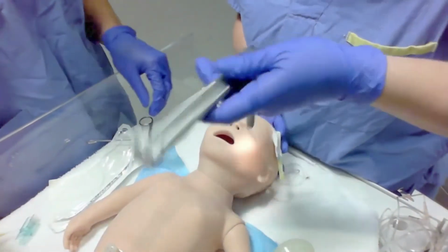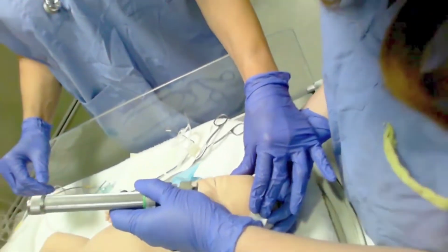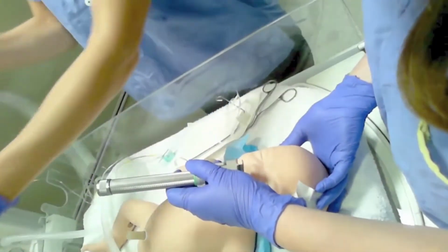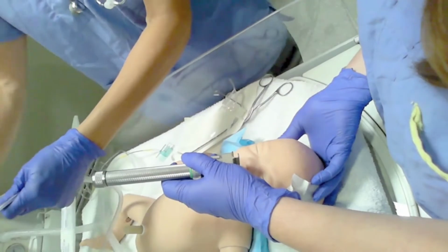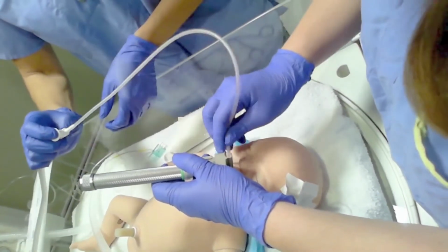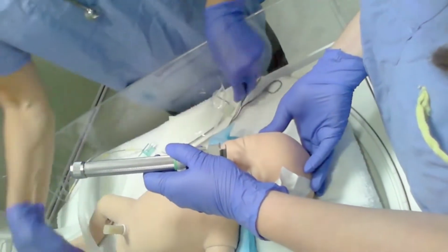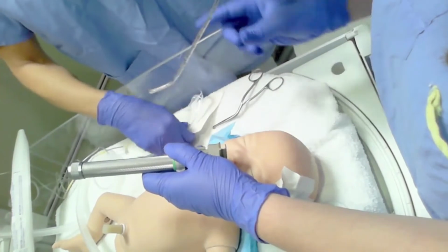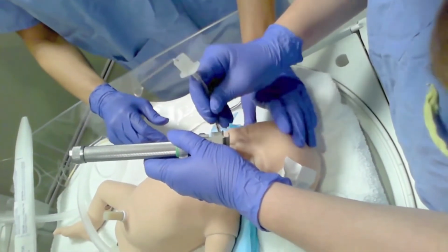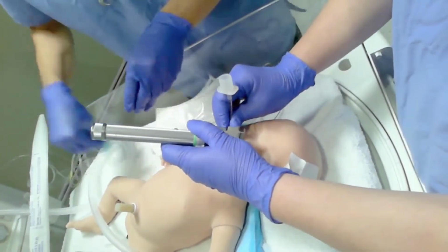First, the person performing the procedure will use a device called a laryngoscope to open the airway and visualize the vocal cords. Confirmation of ETT position can only be unequivocally confirmed if it's visualized passing through the vocal cords. Then moisture is sucked away from the area and the tube is inserted with the help of a rigid stylet insert, which you can see going in now and then will be pulled away after the insertion is completed.